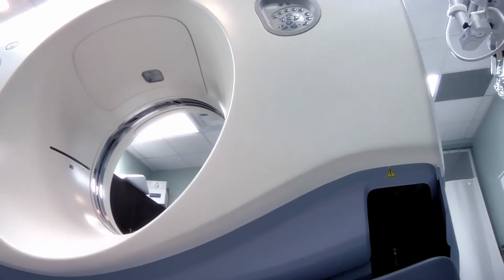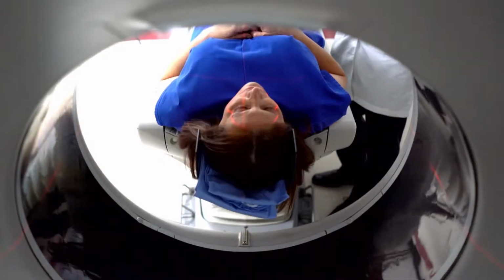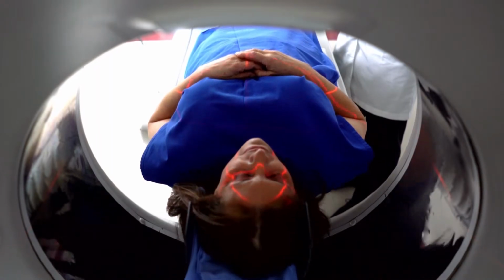Computed tomography uses X-rays like plain X-rays, but it uses a 3D technique. By acquiring images from a tube that circulates around the body, we can actually do 3D imaging of the inside of the body with CT. So we get much better spatial resolution than with plain radiography. But we still have the limitation that it does not pick up the inside of the bone problems very well and does not evaluate the soft tissues. So the bulk of the acute trauma-related injuries to the musculoskeletal system cannot be well evaluated with CT. The only exception are cortical fractures.